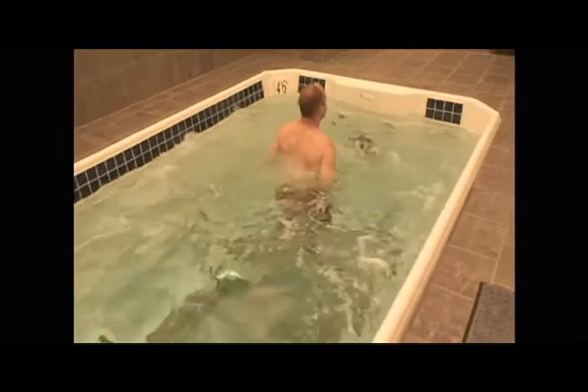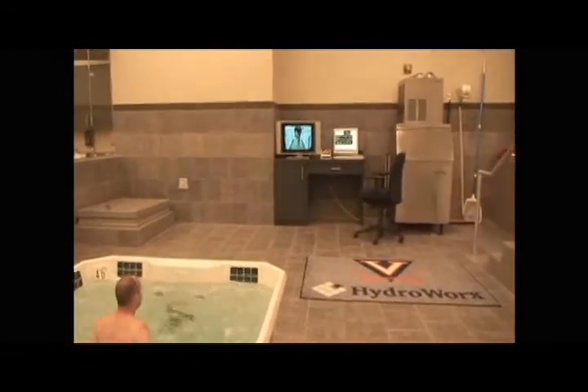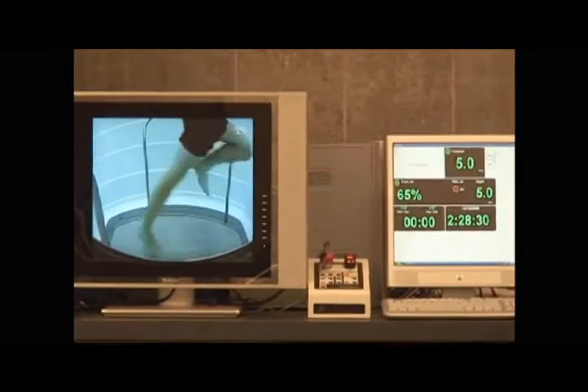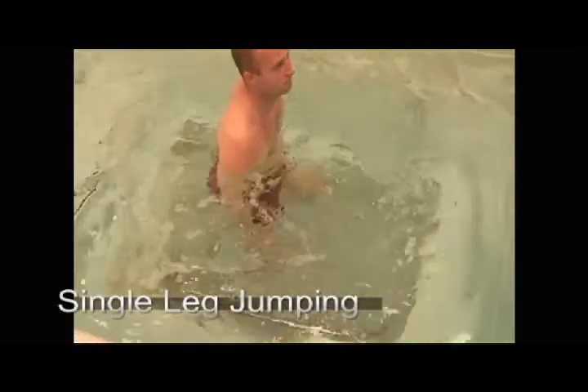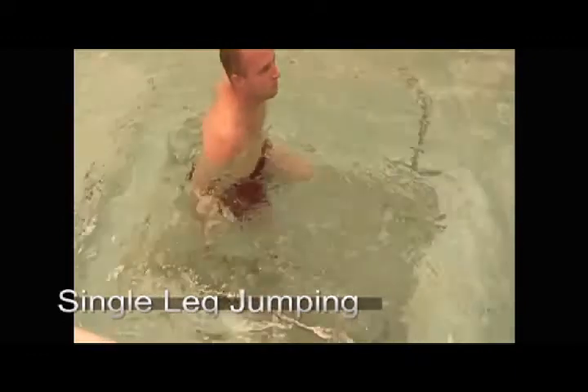The third day in the pool, after a warm-up we started jogging at five miles an hour for five minutes, then six miles an hour for five minutes. We did some more back pedaling, lateral slides, and double-legged hops — then we did some single-legged hops. He had progressed from double-legged to single-legged hops, still in a pretty much non-weight-bearing environment.